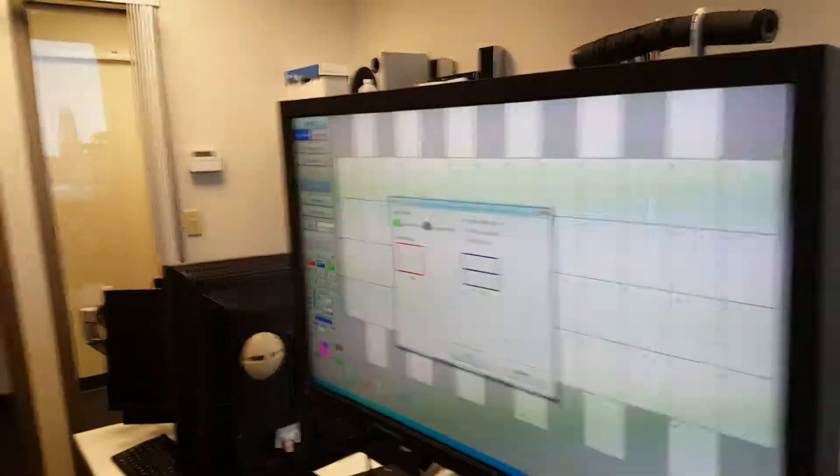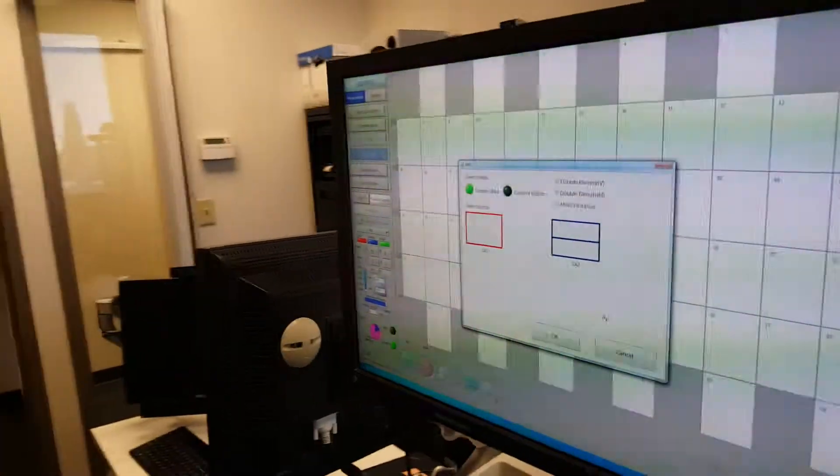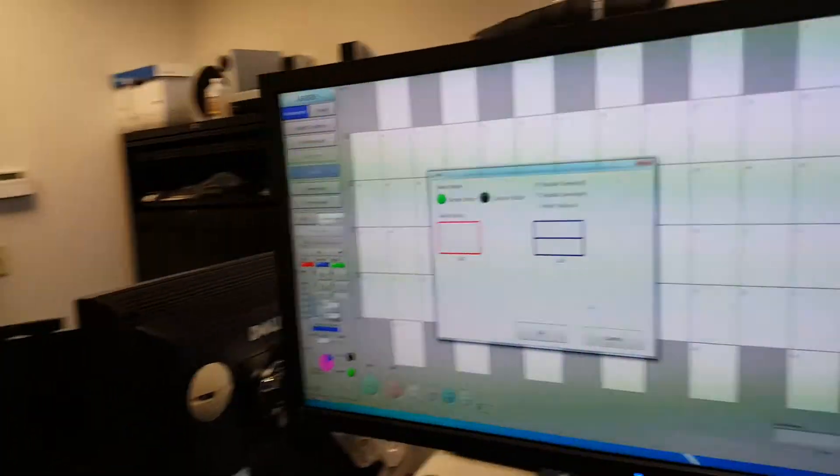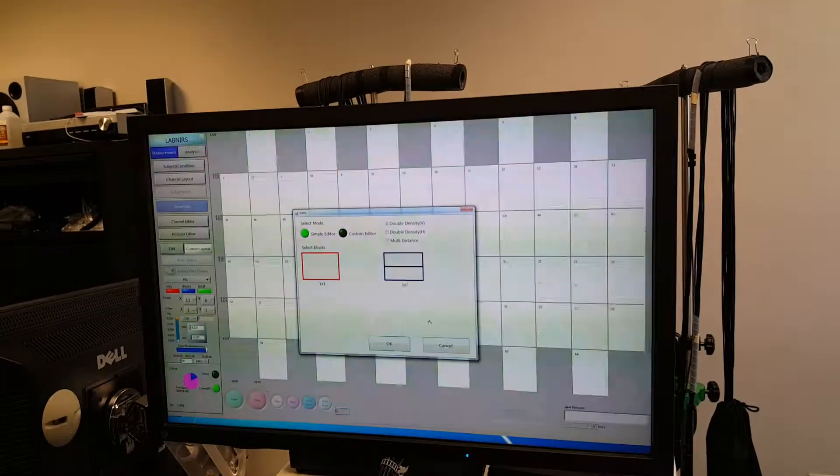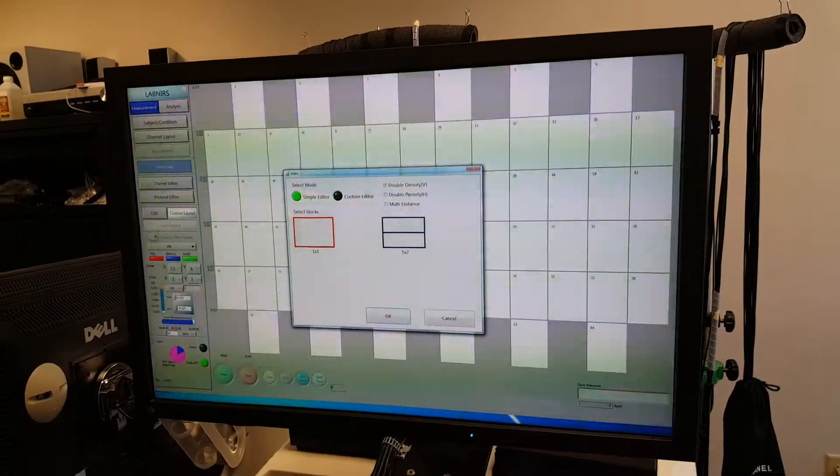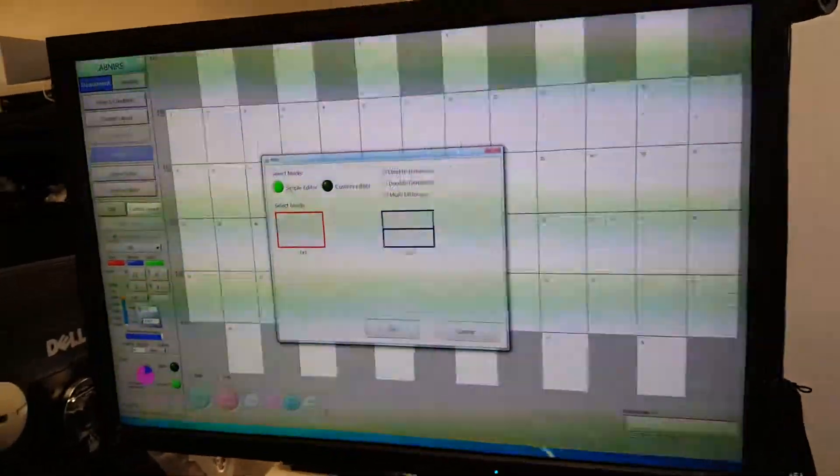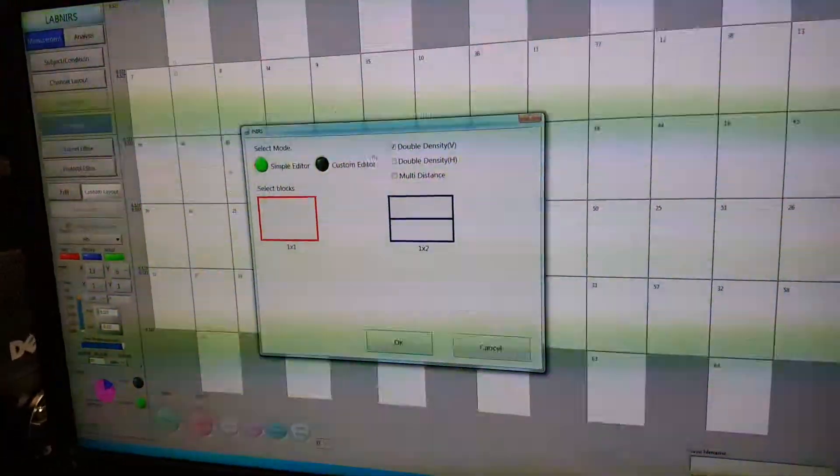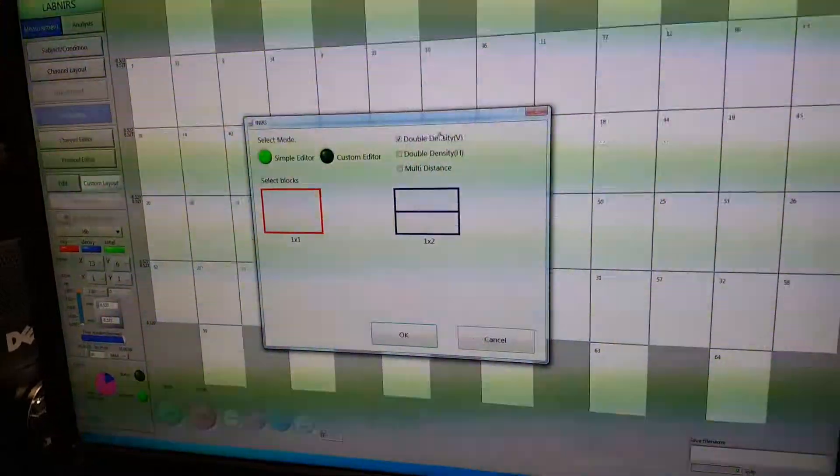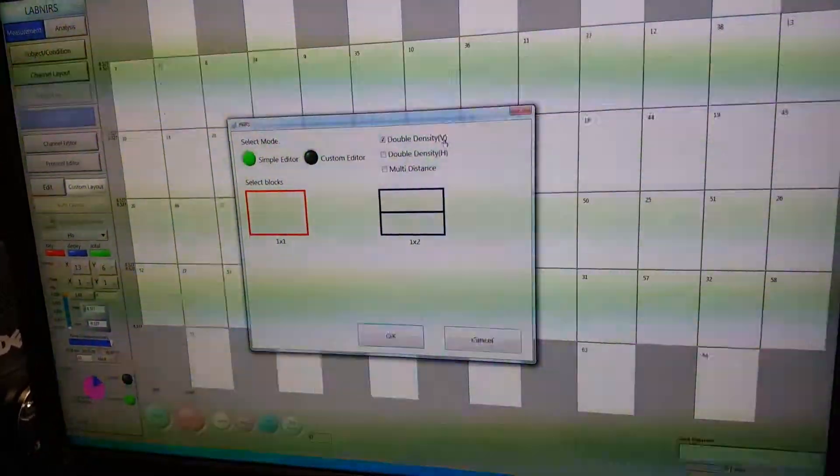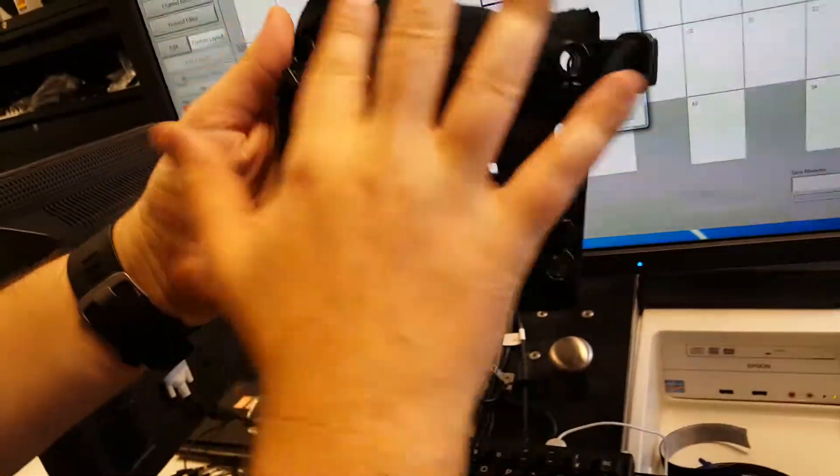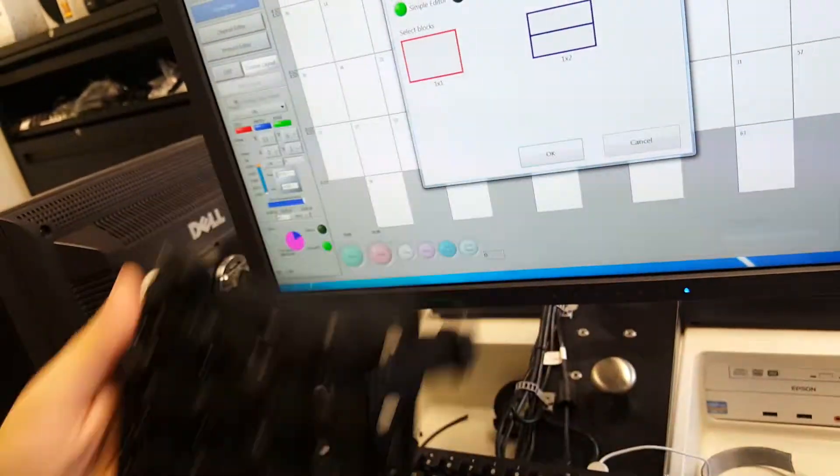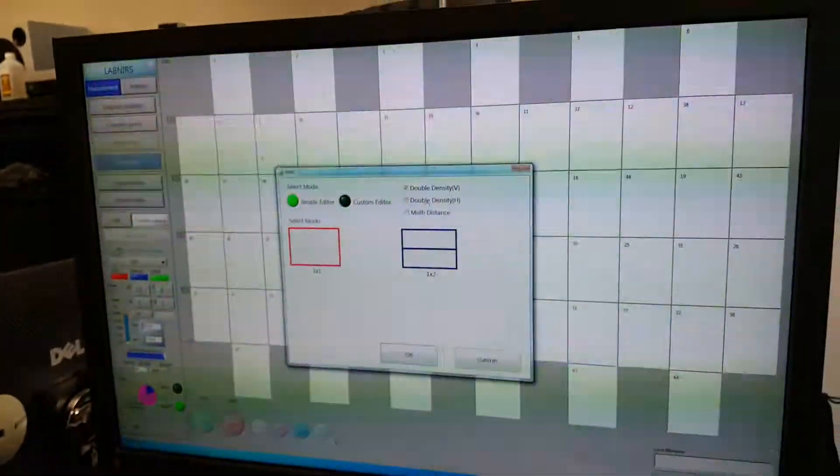Okay, so I figured out my mistake and now we're back. Now we are gonna do a simple editor with the double density in the vertical orientation, so the vertical orientation being this way.